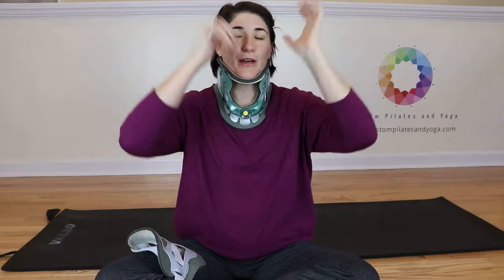Now, anybody who has hair, even if your hair is pretty short, getting this back piece on is a little bit of effort. So if you have a friend nearby, you might have them hold your hair for you.